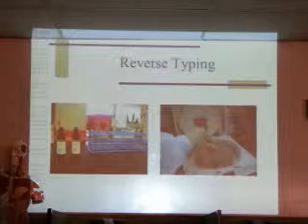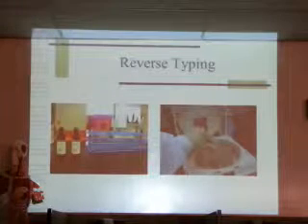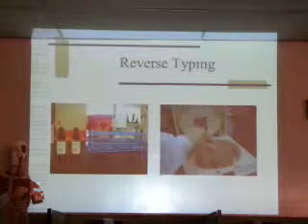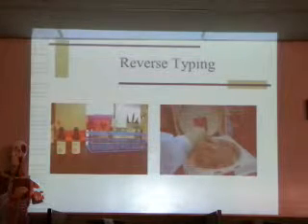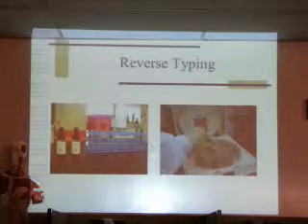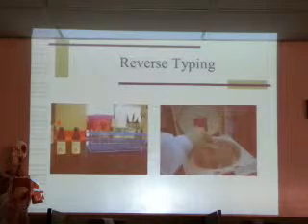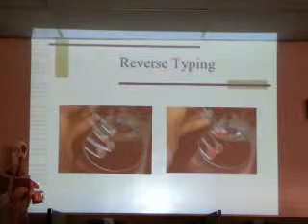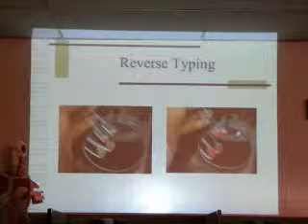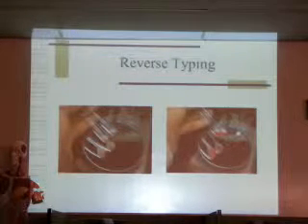So let's look at the tools of the trade. Here is the reagent A cell and the reagent B cell. So this is your red cells of known antigen composition. Again, we use test tubes. We place the reagent red cells in the tubes, and then we add our patient or recipient's plasma, which we don't know what kind of antibody they have. We put it into the centrifuge, let it spin, and when we take it out, we see again that there's a cell button. Gently release that button from the bottom of the tube and you look to see if there's agglutination. No agglutination with A. Looks like there's agglutination with the B cells.